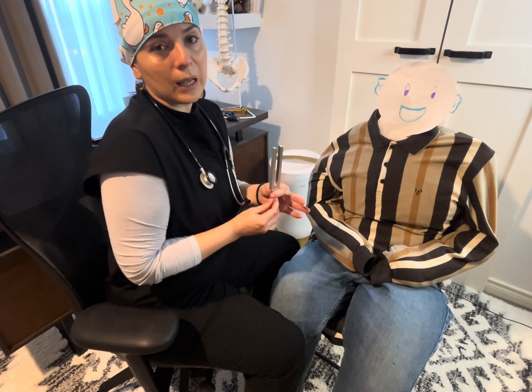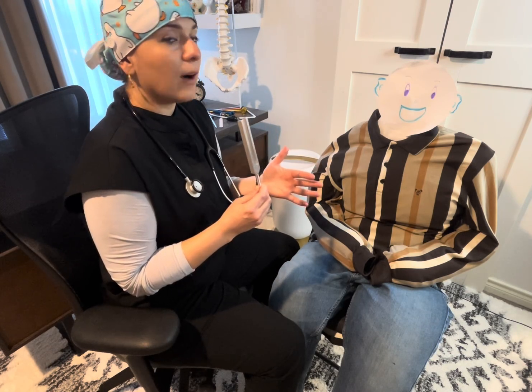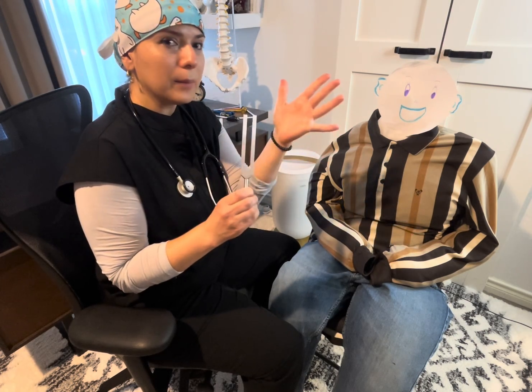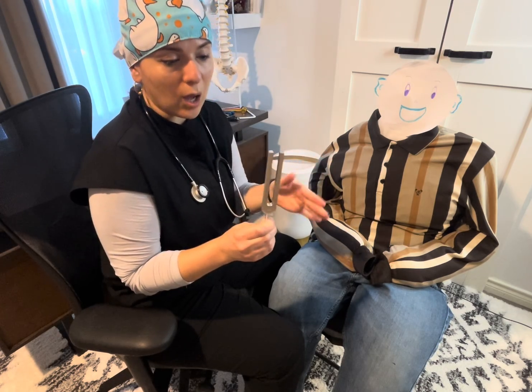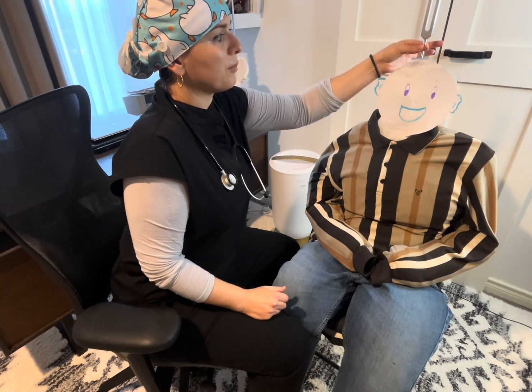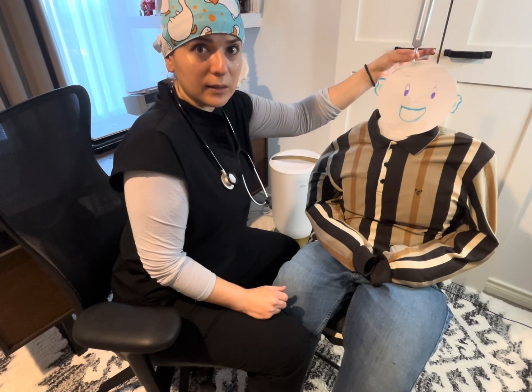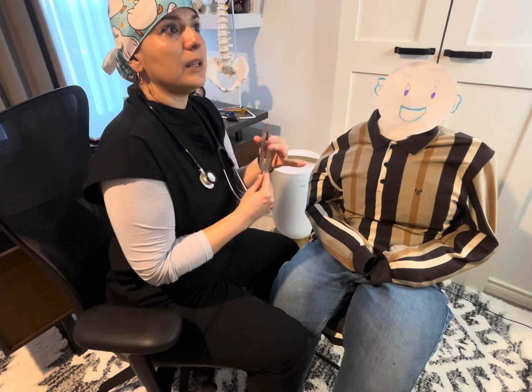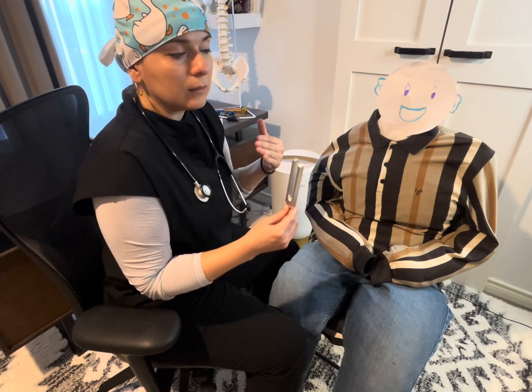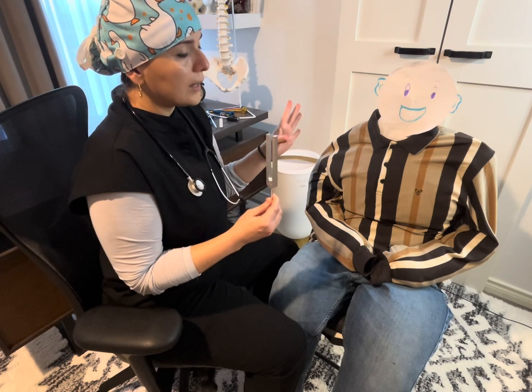For the Weber test we use a 512 Hz tuning fork. We vibrate it and make sure not to touch the top part after vibrating, as that would stop the vibration — we hold it from the base. We place it on top of the patient's head and ask the patient where they hear the loudest vibration. This tells us whether the hearing issue lateralizes to the left or right side.